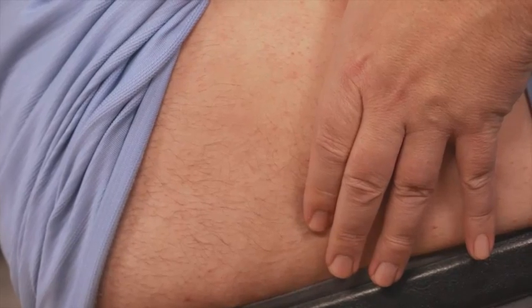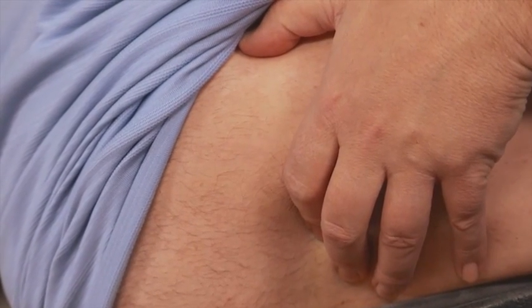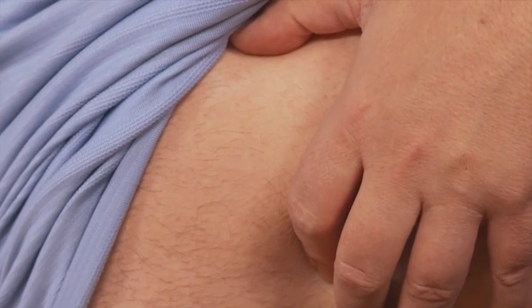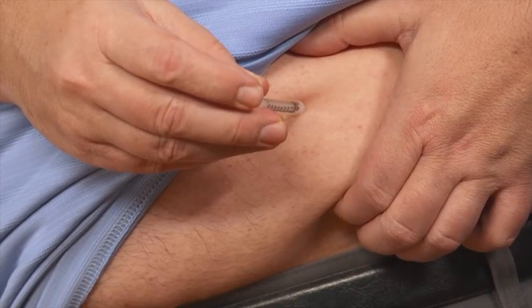Using your thumb and other fingers, gently — not too tight — pinch up the area of skin that you just cleaned. Pinching up helps ensure the needle doesn't hit any muscle and that the insulin is released into the fatty tissue just beneath the skin. In the middle of the pinch, insert the needle straight in. If you're very thin, you might need to inject at a 45 degree angle, but if you're not sure, discuss it with your health care professional. When the needle is fully inserted, slowly push in the plunger to deliver the insulin to your body, then release the pinch as you slowly remove the needle.